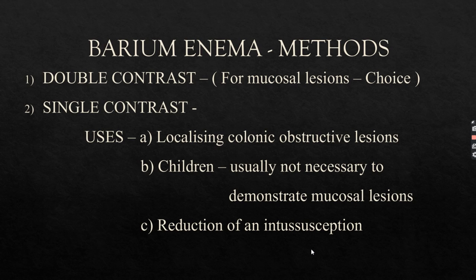So barium enema, again, a few important methods: double contrast as well as single contrast. In double contrast, for mucosal lesions, I have already explained to you, for mucosal lesions, double contrast study is better. The method of choice for barium enema is double contrast.